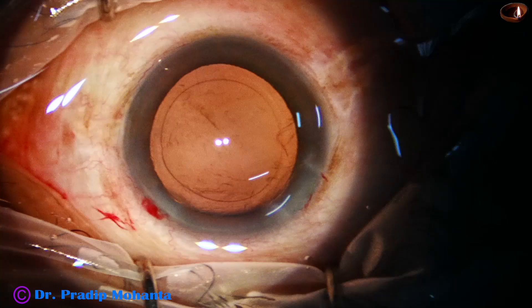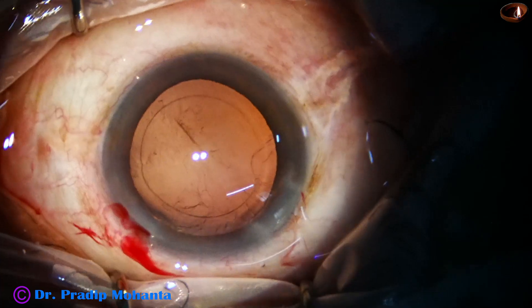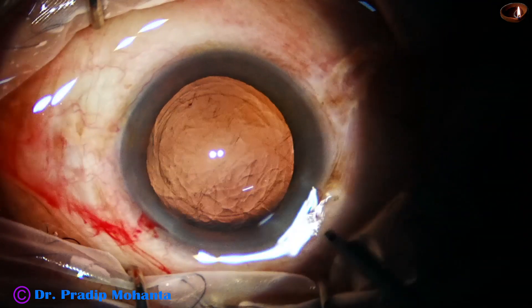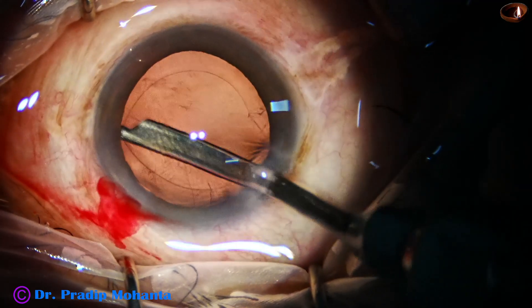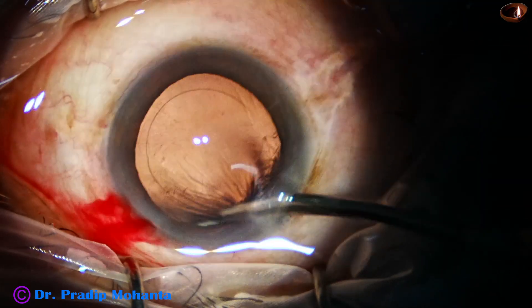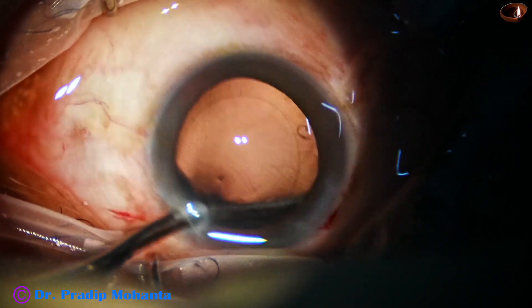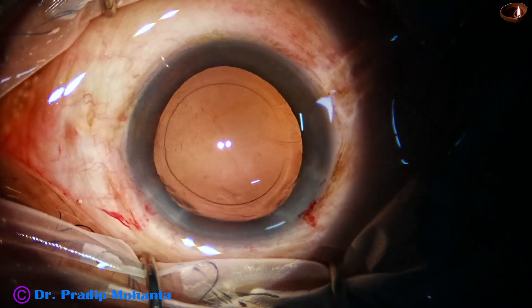The cortex has been removed. Most of the cortex has been removed; however, there are some lens fibers stuck to the posterior capsule here and there — we can polish it out later on. This is a 23-gauge Simcoe and I am removing some lens fibers. When the lens fibers are very few, it is a good idea to use the Simcoe; with coaxial or bimanual IA we tend to hold the capsule and pull it, but with the Simcoe we can easily remove the fibers.